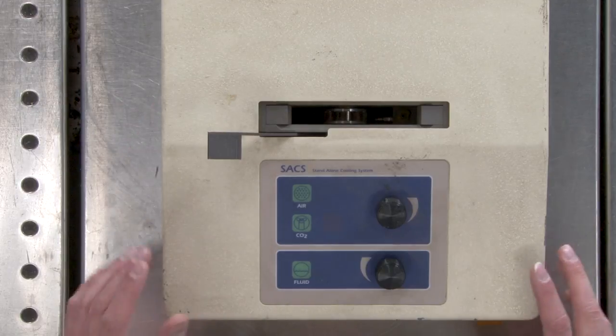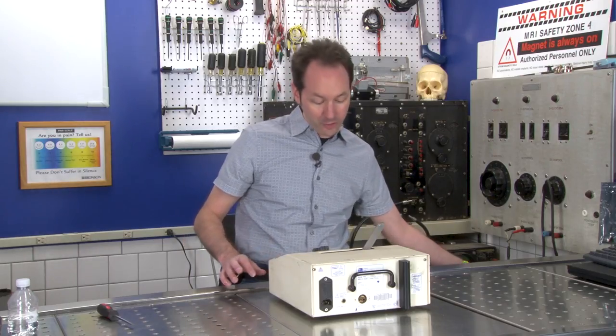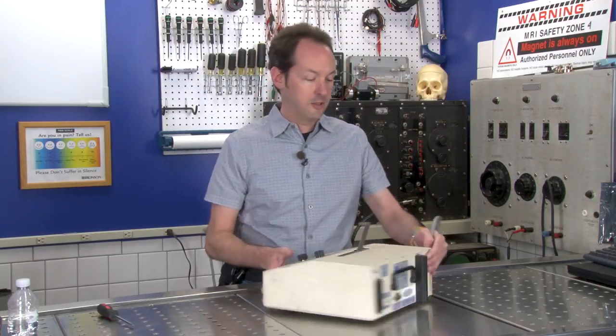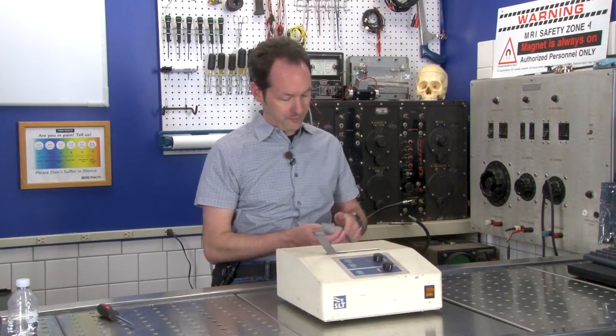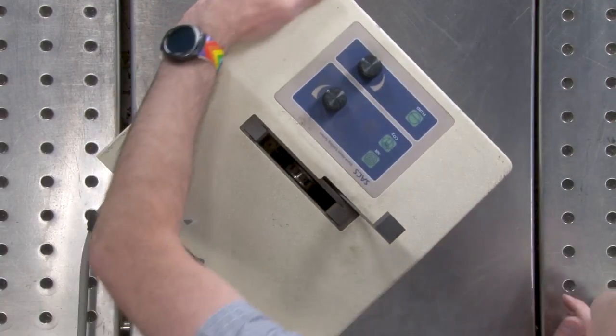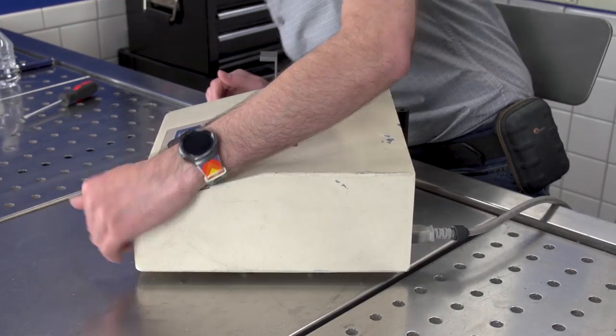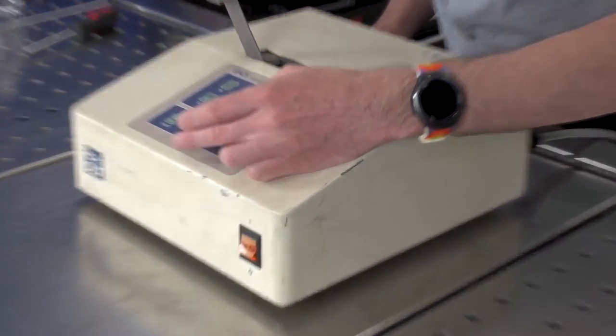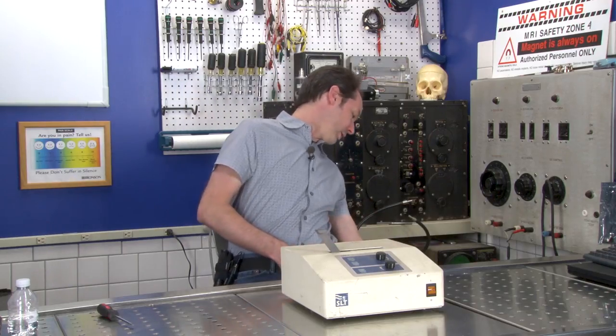Before we really tear into it, it probably still works, so I'm going to grab my plug and fire it up. Let's see what happens. Nothing lights up, nothing moves. So it doesn't work.